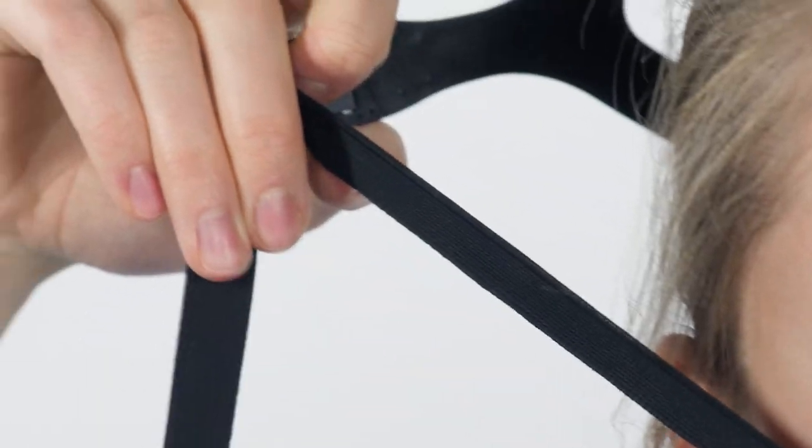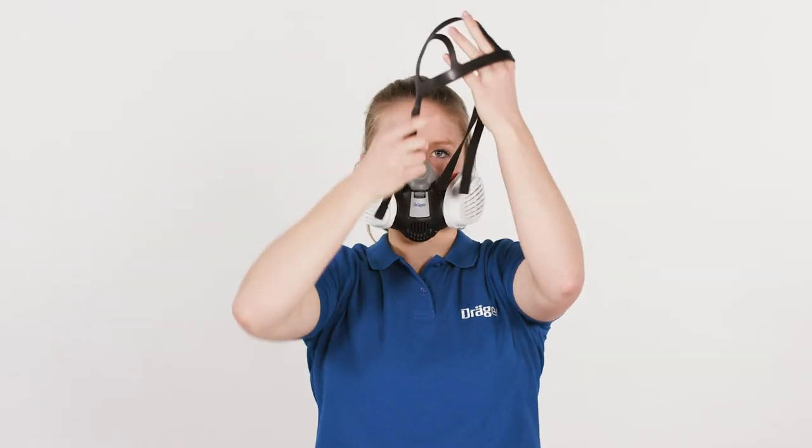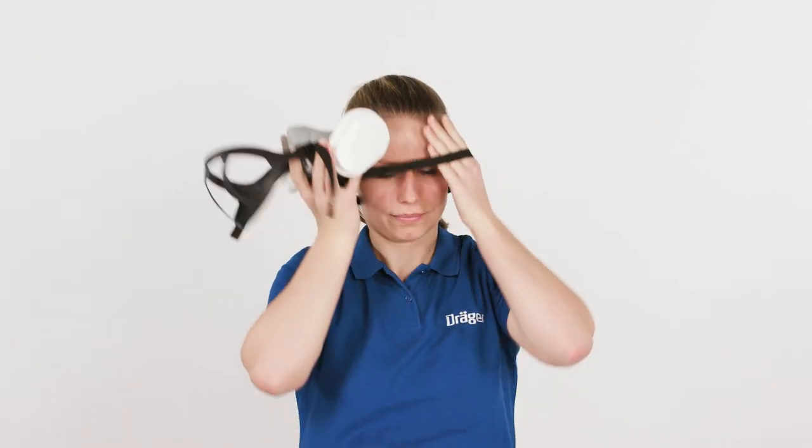Loosen the straps and remove the head cradle. Loosen the mask from your face and pull the harness over your head.